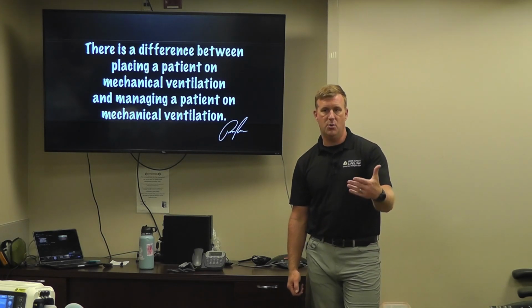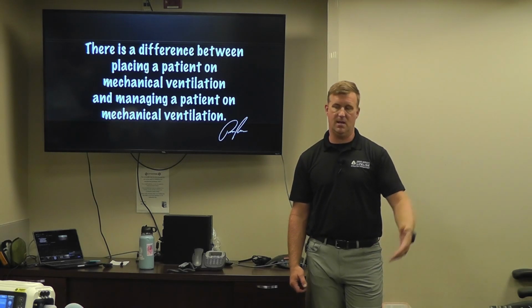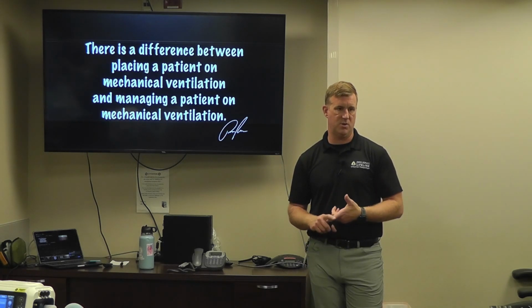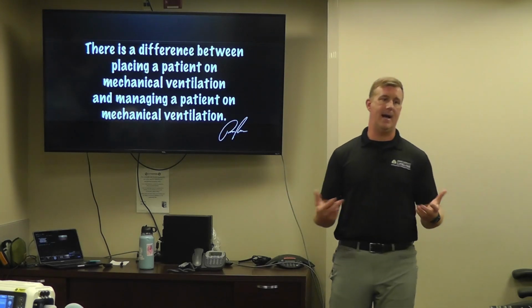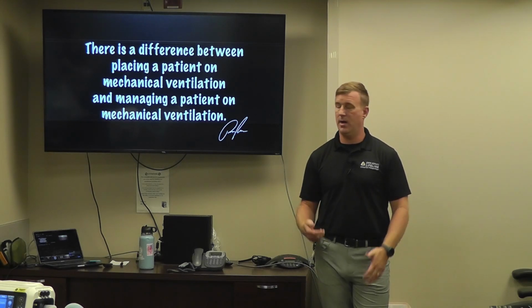But they all will start you with a set of settings, right? We turn this on, it starts with this set of settings. All of you guys probably have some settings in front of you, probably 12, roughly 500, a 1 second I-time. I think we turned them all down to 21% so they wouldn't alarm. But they all start with a basic set of settings. You can put most of your patients on those settings and they're not gonna die. They're not gonna get any better, but they're not gonna die, right? It's gonna continue to blow air.